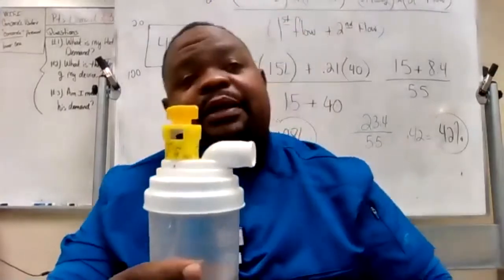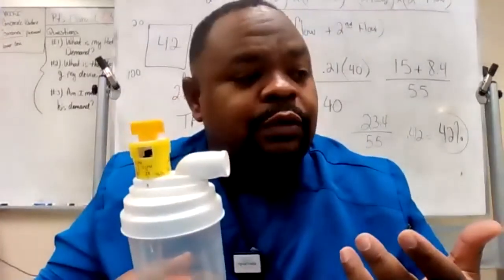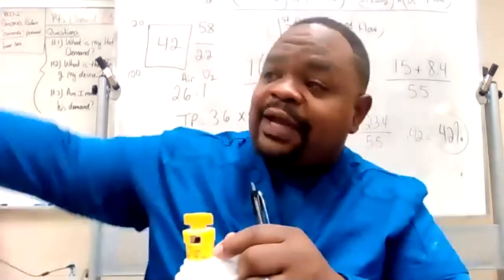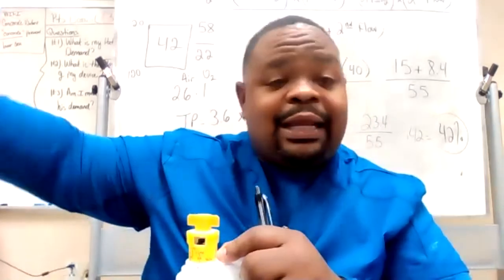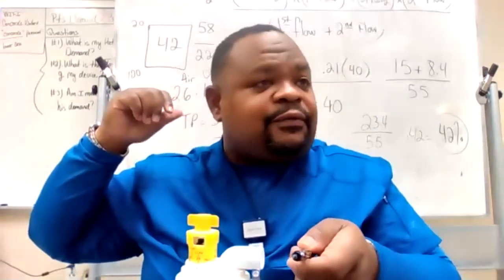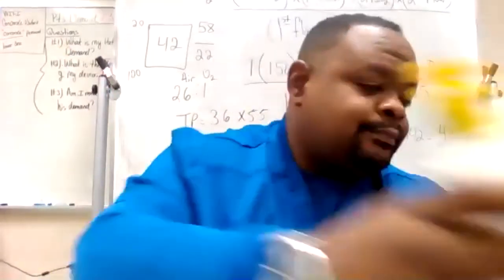It may say 28%, but what if I want to check to make sure? Well, I can use what's called an oxygen analyzer and stick it right into the flow. As the gas passes over the little detector in my hand, it's going to tell me, oh yep, that's 28%. If the words are not on here, or if I have a tandem like we did earlier, and I didn't feel like working out this problem, I can just stick the probe into the flow and it'll tell me how much it is.